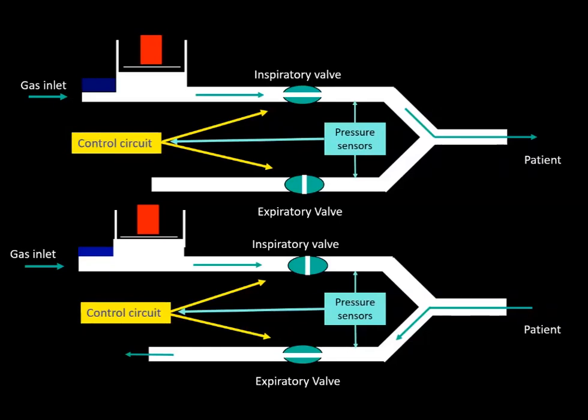If you take a ventilator and disconnect it from, let's say, the test balloon it is connected to, if the ventilator is set on volume controlled mode, there will be just a small flow coming out from the ventilator. You will hear the tidal volume which the ventilator is delivering. But if the ventilator is set on pressure control mode and you disconnect it, immediately there will be a huge flow coming out from the circuit. The ventilator will go because it is trying to get to the target inspiratory pressure.